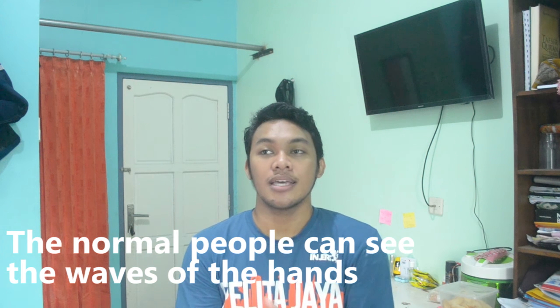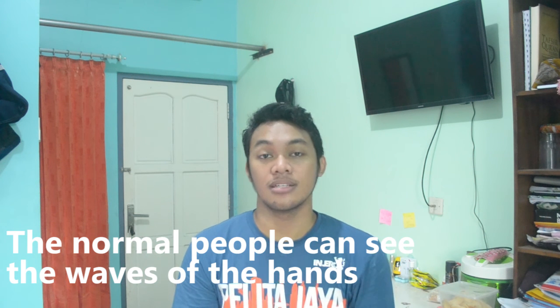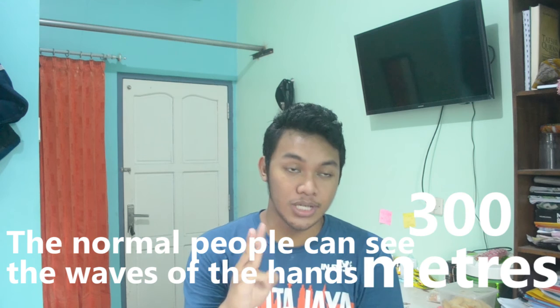If the patient can't determine the number of fingers, then we can do a hand wave test. So it can be stated that the patient's sharp vision is worse than 1 per 60. Normal people can see the movements or waves of the hands at a distance of 300 meters. So if the patient passes this test, their sharp vision is 1 per 300.